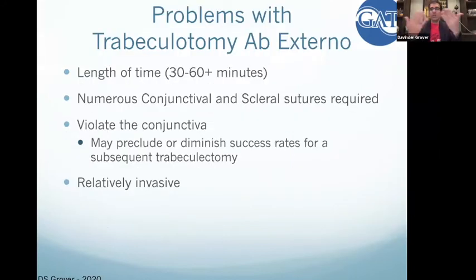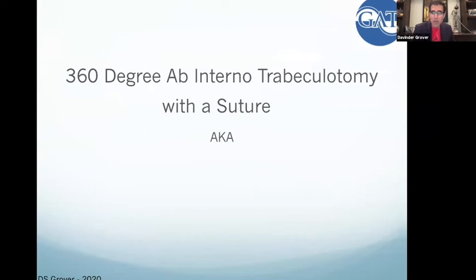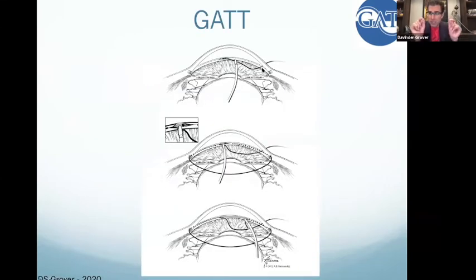But what's the problem with that ab externo technique, right? You have to do a conjunctival dissection, a scleral flap, and it takes a long time, and it's pretty invasive. And so we're seeing this evolution of trabeculotomy in our lifetimes, in the past 30, 40, 50 years. And our group, myself and my partners, have come up with an ab interno trabeculotomy, or a GATT surgery, where you are within the eye through two small paracenteses with a suture or a catheter, cannulating, passing it around and retrieving it, and basically being able to do a 360 degree trabeculotomy without doing a flap and a conjunctival dissection.